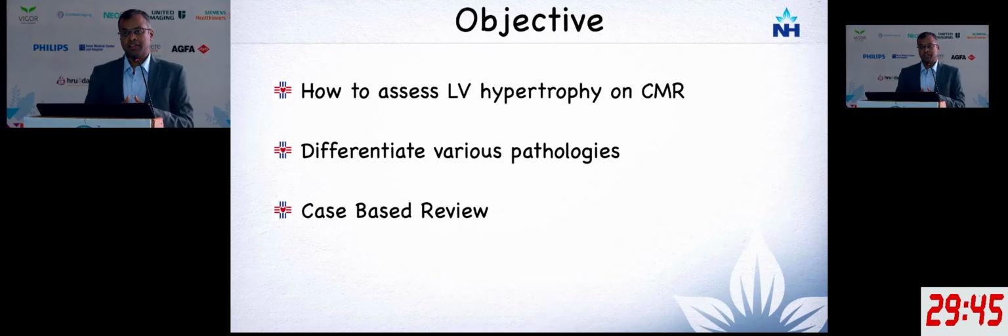My objectives are to tell you how to assess LV hypertrophy on cardiac MR, and how to differentiate various pathologies which can present with LV hypertrophy. But the main cornerstone of my presentation is that there are lots of cases. I'm just going to show cases.